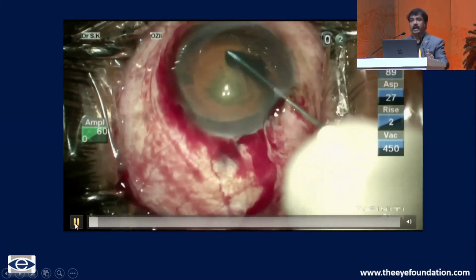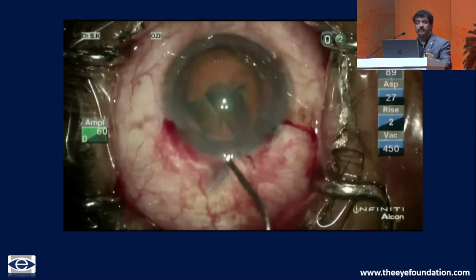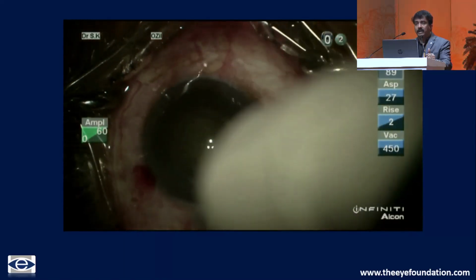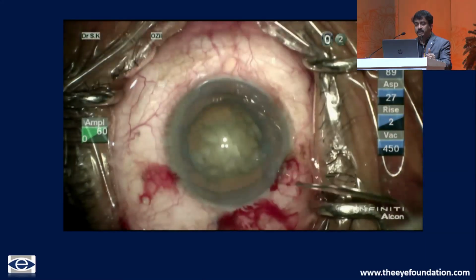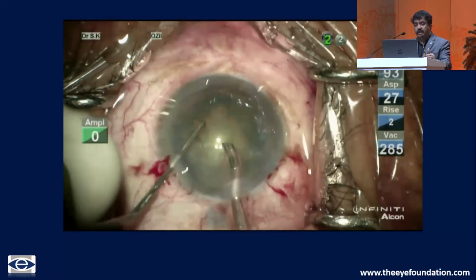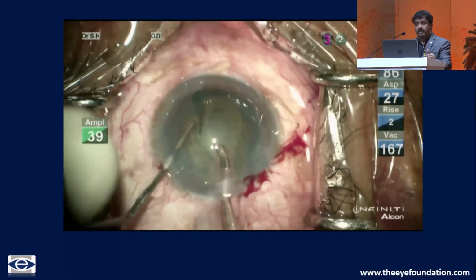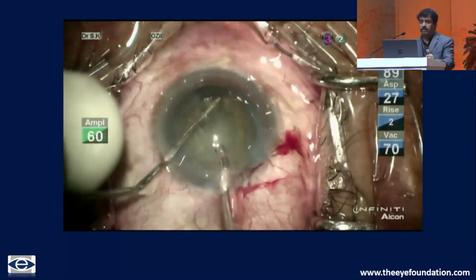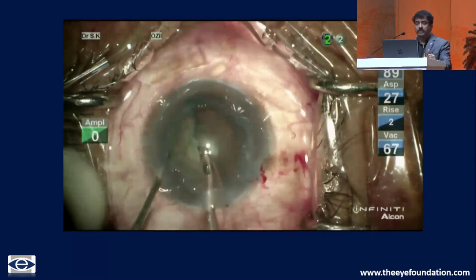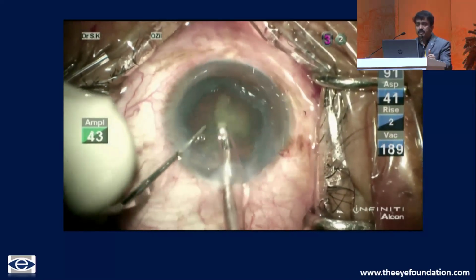This is a case, a moderately hard cataract. It's not as soft as the previous cases, and I'm trying to do hydrodelamination here, but was not successful. So I'm planning to do a mechanical delamination, using a Sinskey hook, just delaminating the nucleus from the epinucleus. It's a grade 2 to grade 3 cataract, and then you do your chopping technique, in situ chopping, and try to separate the heminucleus from the epinuclear cushion, and do all your manipulation under the cover of the epinuclear cushion. Using moderate parameters, I usually complete the procedure.